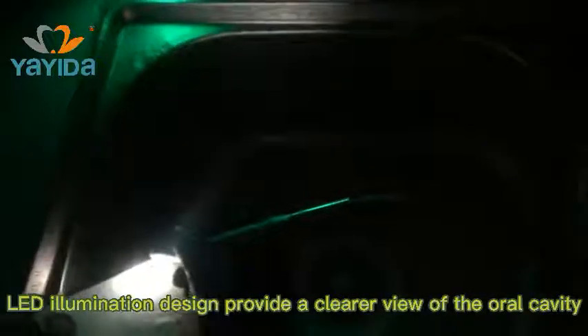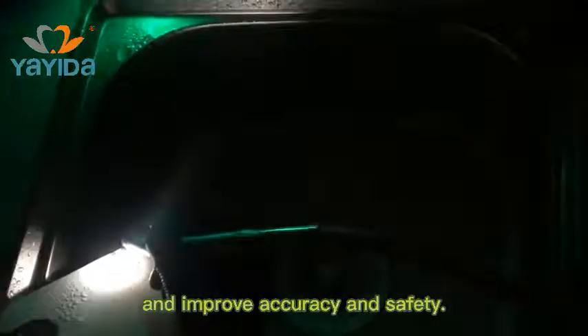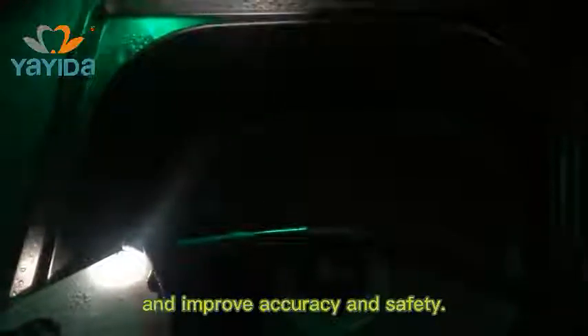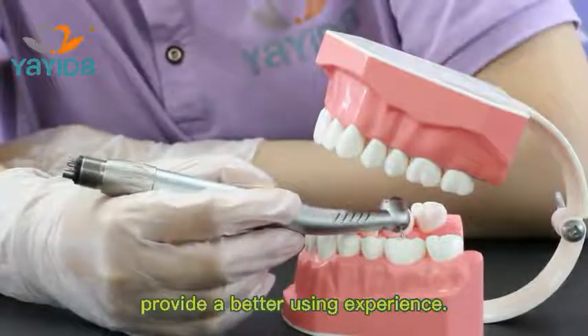LED illumination design provides a clear view of the overall cavity and improves accuracy and safety. Ergonomic design and comfortable grip provides a better using experience.